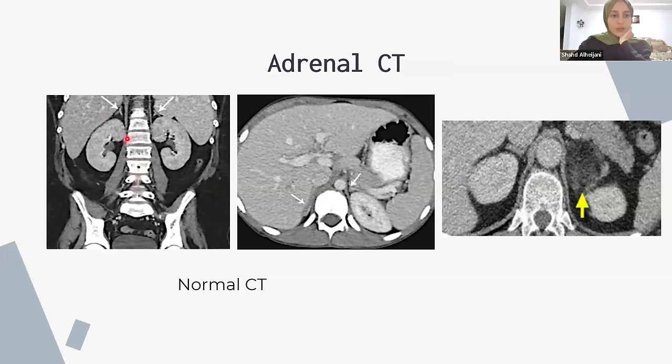Here you have the vertebrae. Here you have the iliopsoas muscles. And here you have the start of the femur. Here you have the iliac crest and so on. And we'll focus on the kidneys. You have the little triangles here. Those little triangles are the adrenal glands.